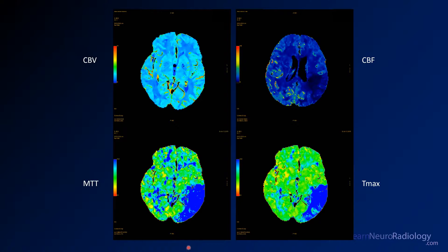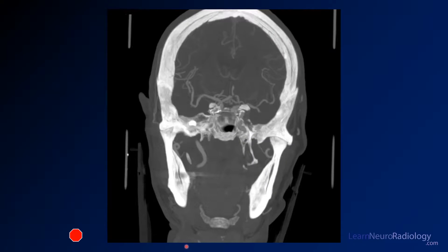Let's take a look at those — in perfusion, symmetry is your friend. Finally, you see some images from a MIP of a coronal CT angiogram through the head. Look to see if you find any areas of associated abnormality.